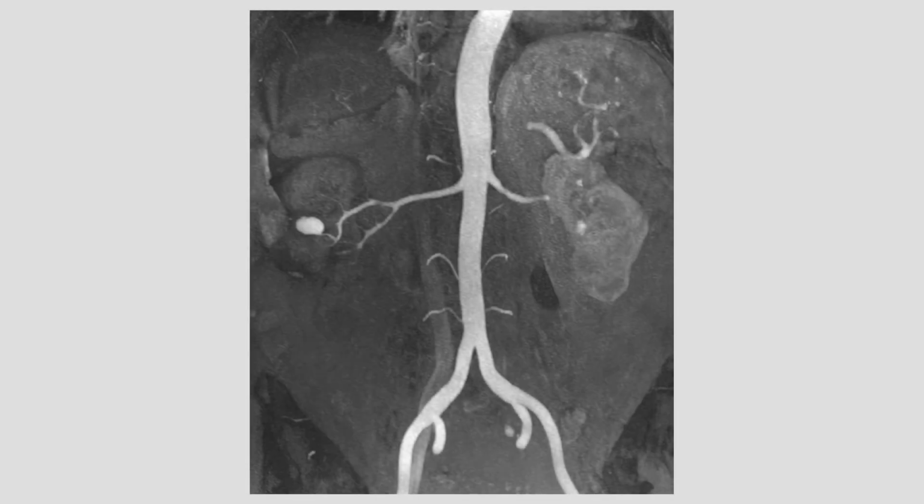And the third one is the renal artery MRA. We spoke about hypertension. We spoke about AAA, the abdominal aorta. As you can see, it's the biggest artery in your body, so the flow in it is just amazingly fast. It comes out of the heart, goes all the way down, and separates and supplies blood to the rest of the body. It goes to your groin from this picture. And the very last one we want to show is number 4, which can also be referred to as MRA runoff, which is basically the study from the kidneys all the way down to the feet.